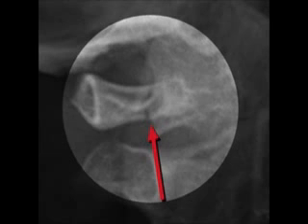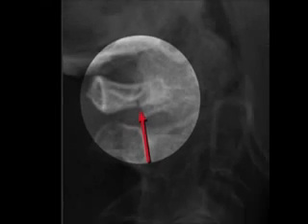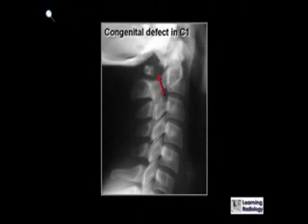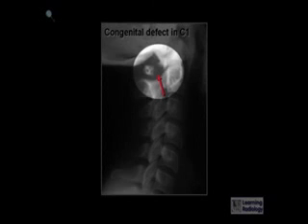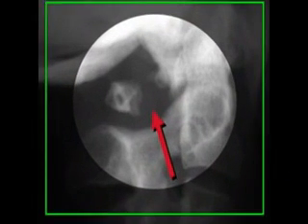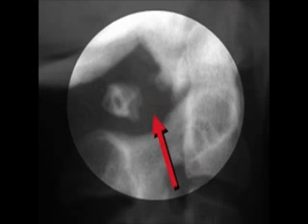This, on the other hand, is a congenital defect in the neural arch of C1. You can see that the lucency is surrounded on either side by a sclerotic and somewhat smooth edge.